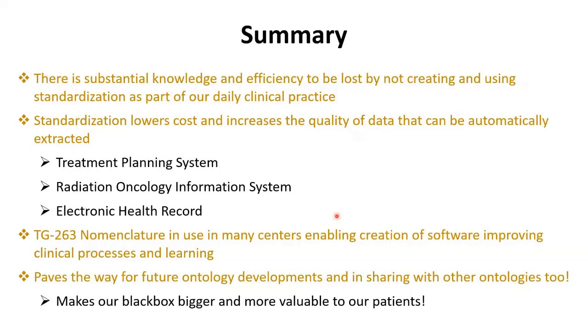TG-263 nomenclature is in use in many centers, enabling creation of software, improving clinical process and learning. If you would like to share your data with other centers, if you would like to make a combined study between you and other centers, this is very important because both parties should speak the same language. They should have the same way of communication. It paves the way for future ontology development and for sharing with other ontologies too. You can easily expand your database based on this. Okay, you have the standard, you have the rules, then you can build whatever you would like.